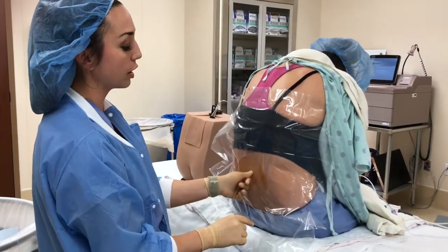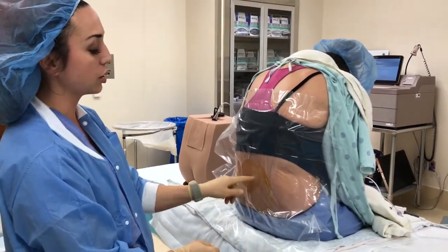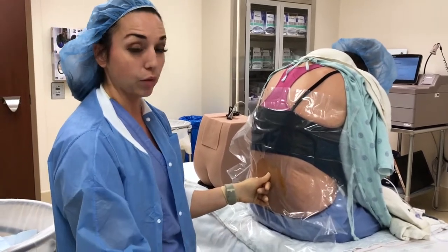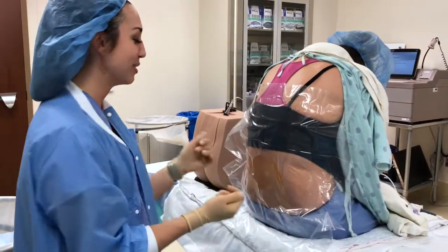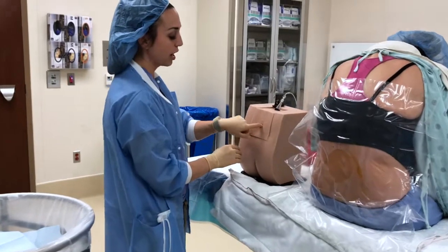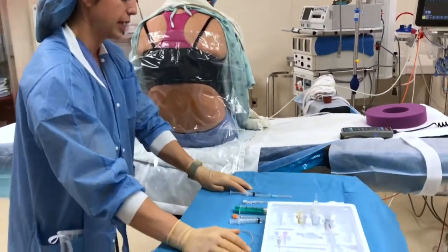Okay. Usually you'll see a lot of people press a fingernail in as an indentation so that they can figure out where they're going. A lot of times I'll just hold it and then get ready for my lidocaine injection. Okay. At this point we'll transition to the mannequin. So if this mannequin is Dr. Turner, if we found our space, the first thing that we're going to do is numb the area.